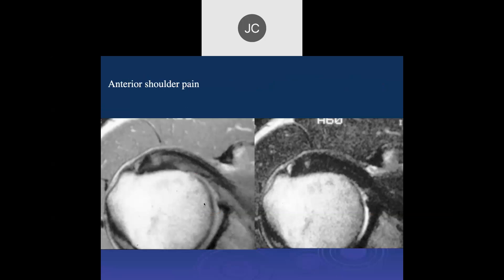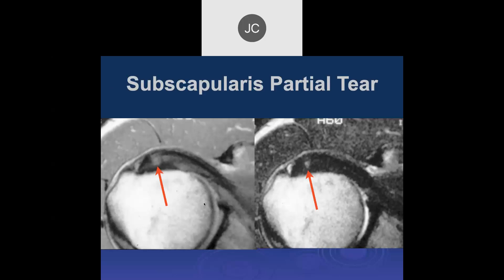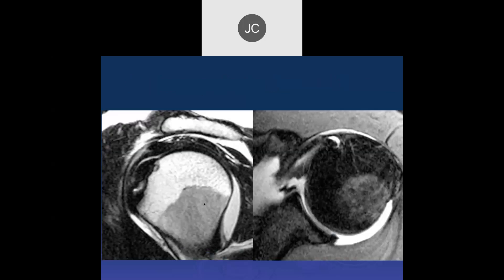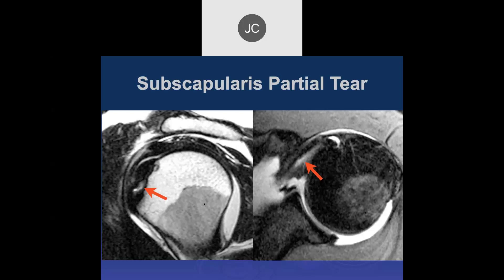Anterior shoulder pain: looking at the subscapularis, there's some tendinosis at the insertion. This is an early subscapularis partial tear. On sagittal and axial views, there's a focal increased signal within the subscapularis that doesn't connect with the bursal surface — it looks intersubstance. So this is an interstitial partial tear, bigger than the one we saw before.